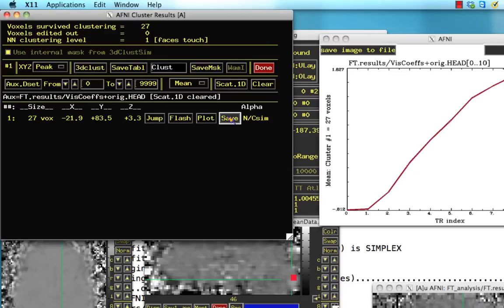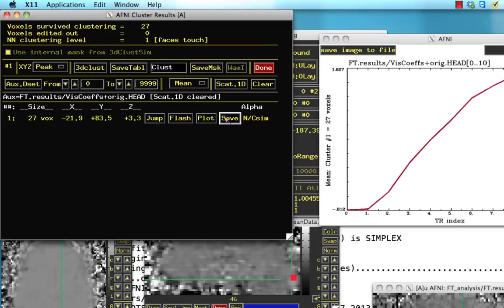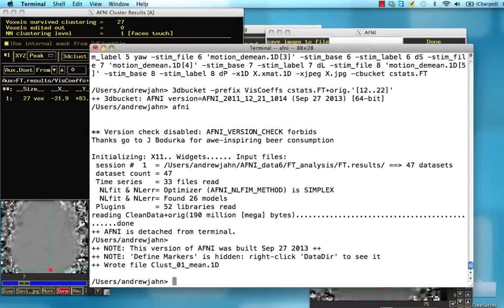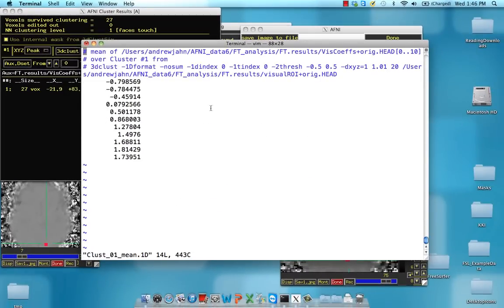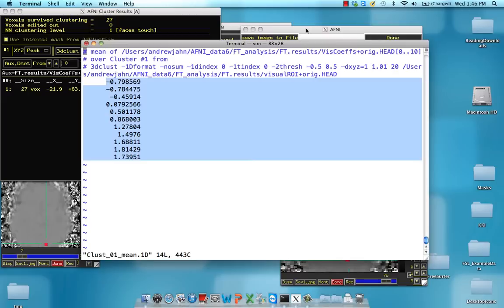So I hope that's pretty clear. I can save that out and this is going to make this cluster 01 mean, and notice here all the estimates for each time point in this graph right here.